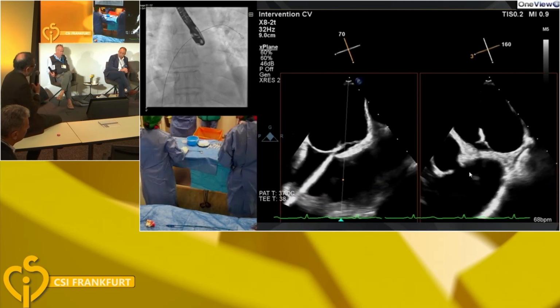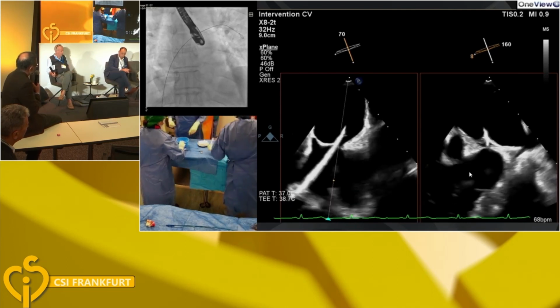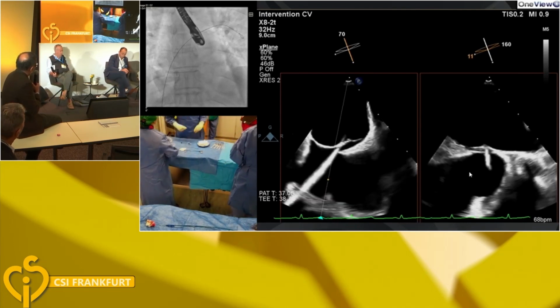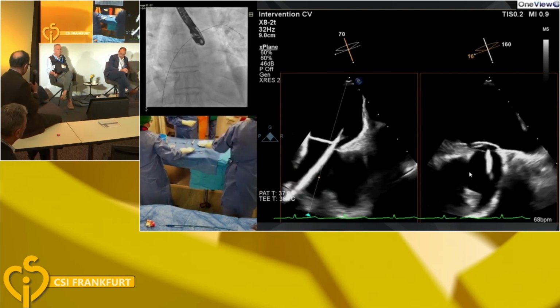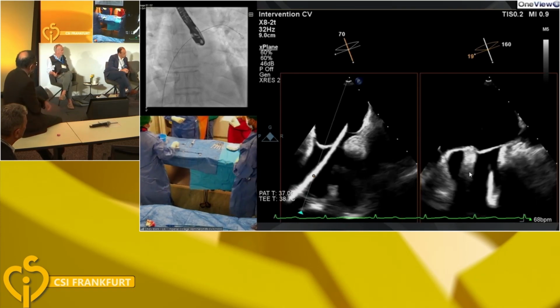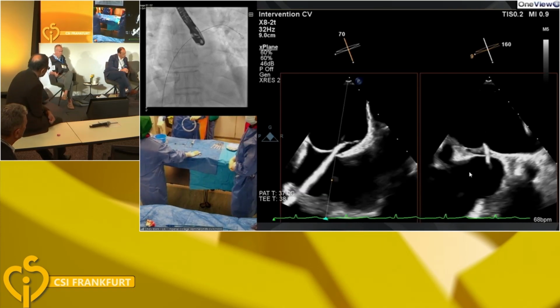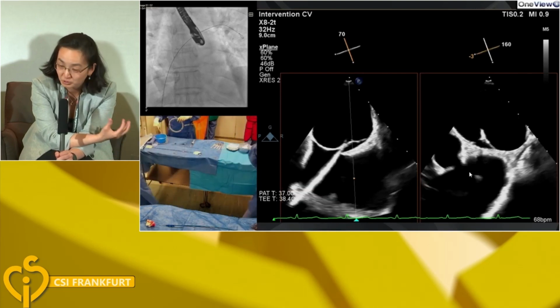I don't think skin nickel allergy has anything to do with what happens inside the body, so I don't test for it. But some patients go that way and say it's a coated device, therefore there's less risk of an allergy. Yeah, we had a lady who turned beet red, had a nickel allergy, and we put a device in her, and she was miserable. We had to remove it, and then she turned normal color again.